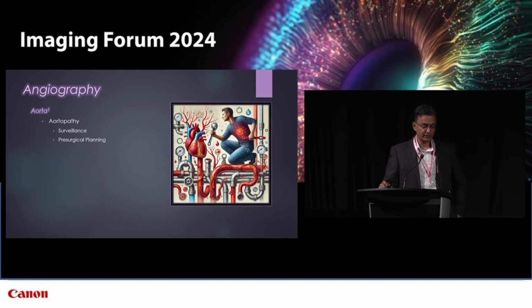It's also another area of growth we've noticed in our community partner institutions. Through our PAC system, people are getting more and more referrals for surveillance of aortopathies in our surrounding hospitals. In addition to doing that surveillance in London, because of our cardiovascular footprint, we are often looking at pre-surgical planning for these patients.